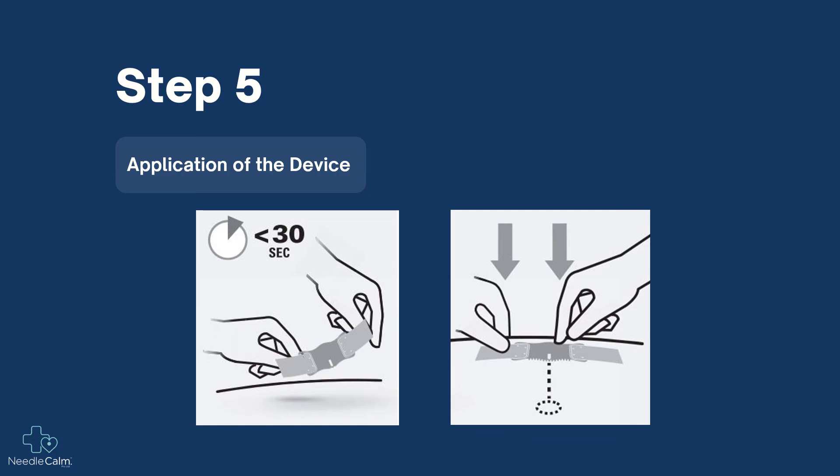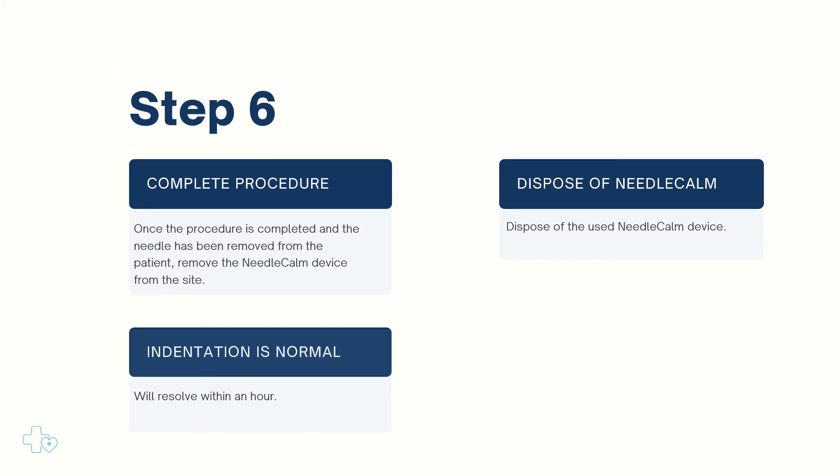Once the procedure is completed and the needle has been removed from the patient, remove the Needle Calm device from the site by gently peeling back the silicone tape from the patient's skin.